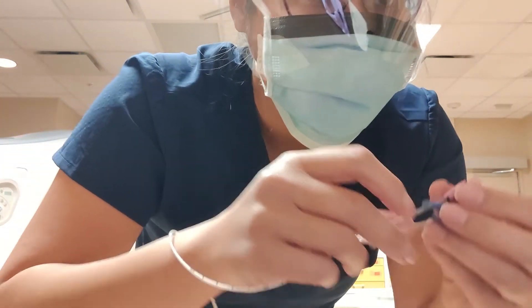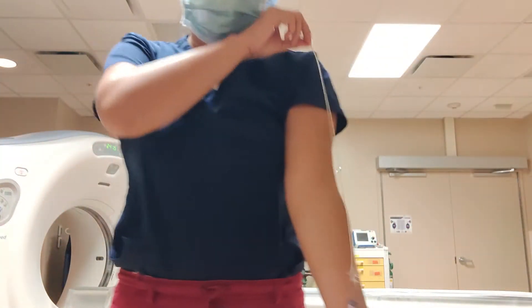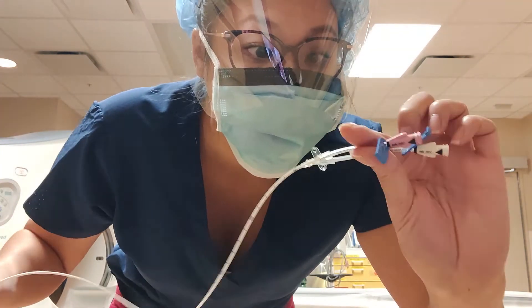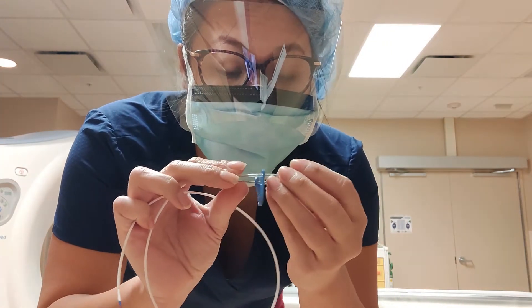Very cool, very interesting. So this is your PICC line — it goes through your arm all the way to your heart. You can get medication through here, have blood drawn, or receive IV fluids.